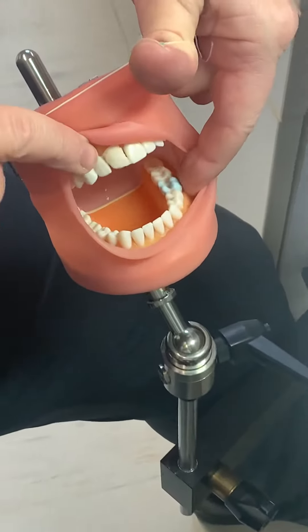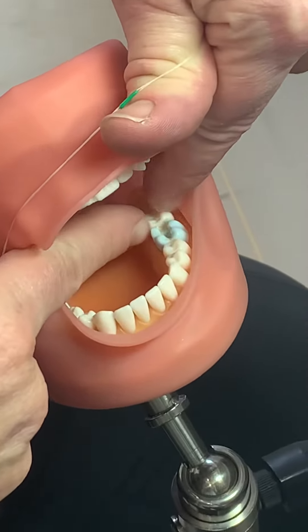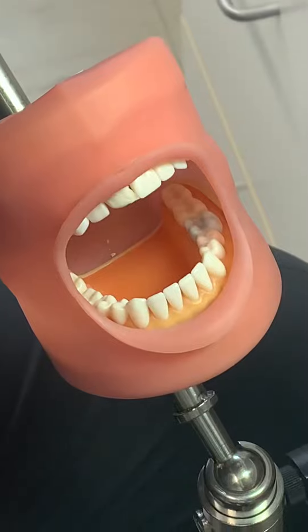If we're going to put a band on tooth number 19, we need to put a separator on the mesial of 19 and the distal of 19, so that after a week or five days when the patient comes back, we've got a little space created there so that the band can seat down.